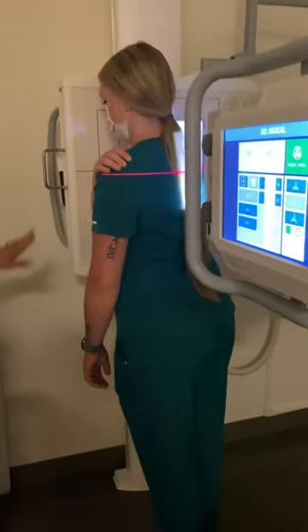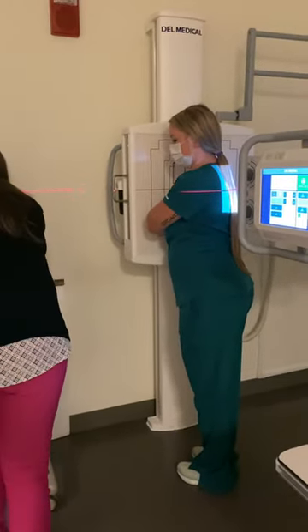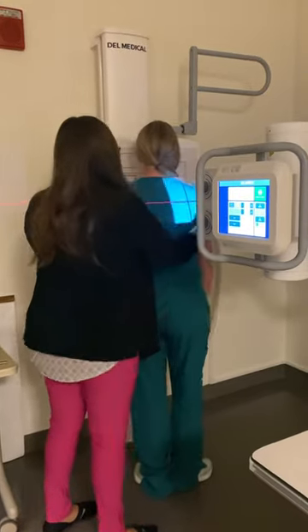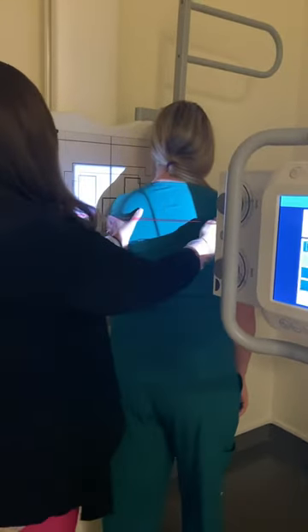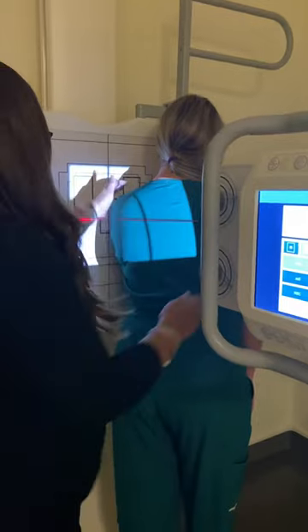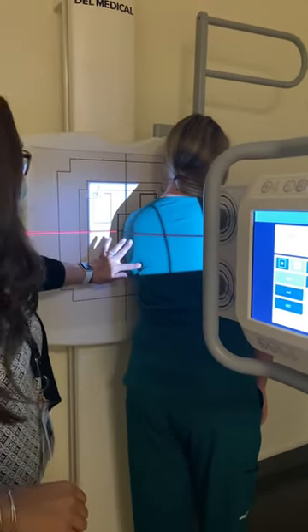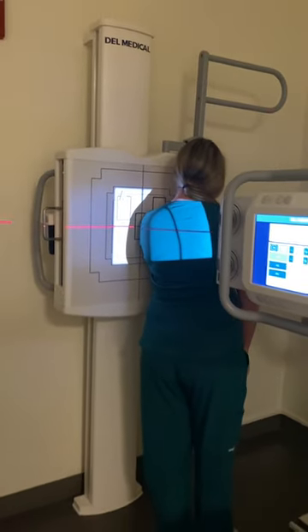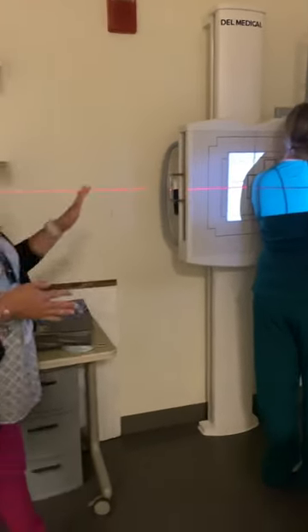Let's switch to the left side just so you can see for this. If I was doing a left scapula Y view, I'm going to turn my patient 45 degrees towards the affected shoulder. Then I'm going to center right over the medial border of the scapula. I'm going to put my left marker in the upper corner. I want to make sure that I get the entire body of the scapula on there, and my patient is at a 45 to 60 degree angle. I would also turn my lap shield around so it's on her back side. I would have my patient suspend respiration - hold your breath, don't breathe. And that's it for scapula.